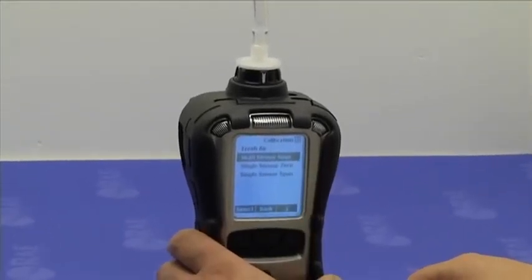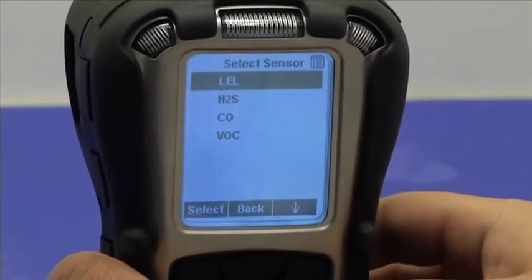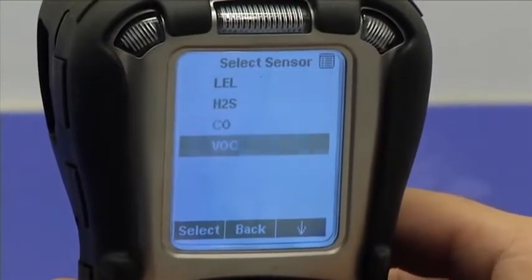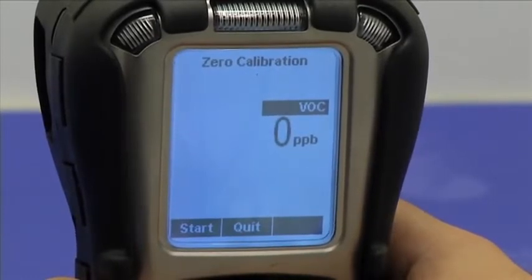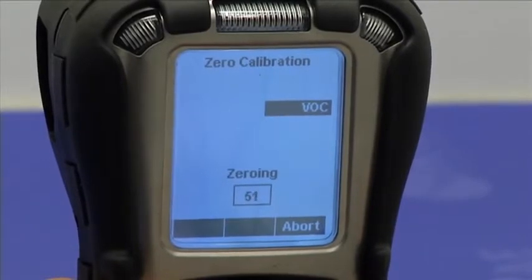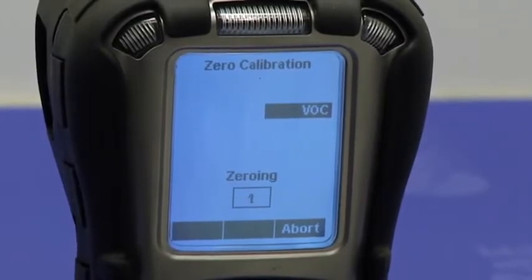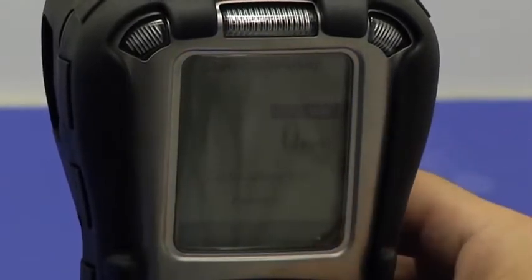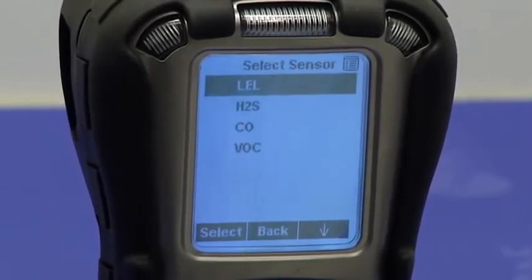Then under the calibration menu, I'm going to select single sensor zero and pick the VOC sensor, which is our PID. I'm going to press select and start. When the zero calibration completes, the instrument will show me the pass fail calibration status for the PID sensor. It says zero calibration passed, and the reading is zero PPB. Exactly what we need.